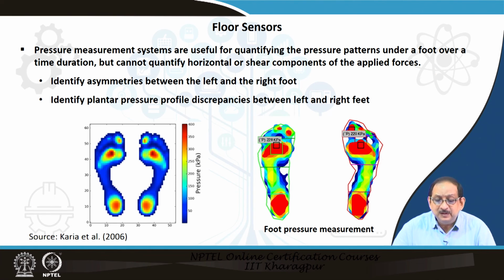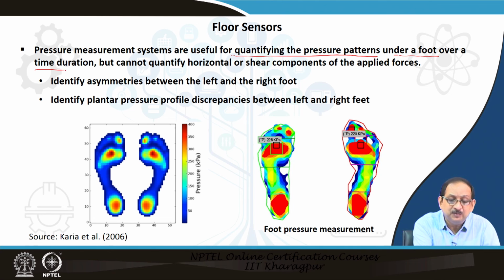Now, let us come to the pressure measurement systems. The system is useful for quantifying pressure patterns under a foot over a time duration.